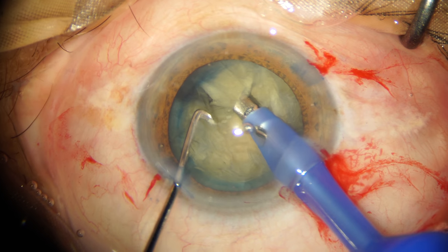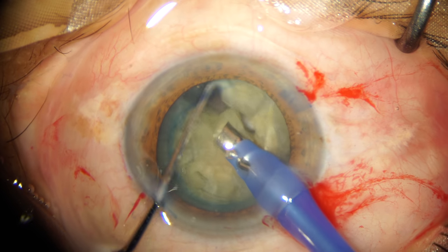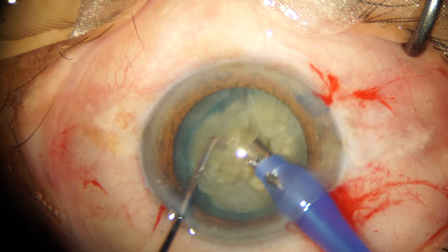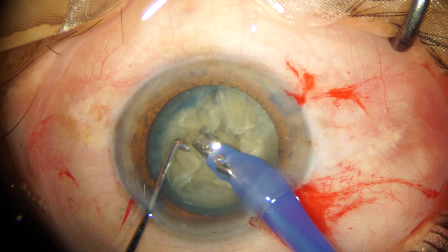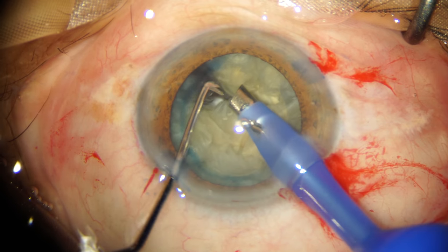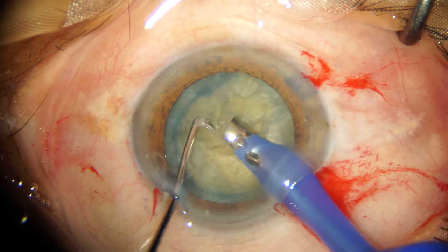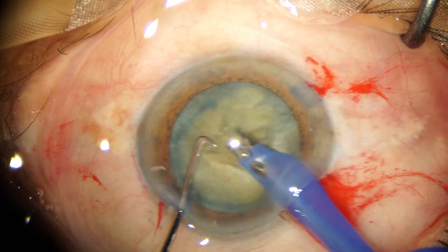At this point, the vacuum I use is about 400 millimeters of mercury and it is a fixed vacuum — the rise time is very fast. When I move to the quadrant removal part of phaco emulsification, I keep it linear, meaning the rise time will respond directly to the amount of pedal excursion I do in foot pedal position 3.